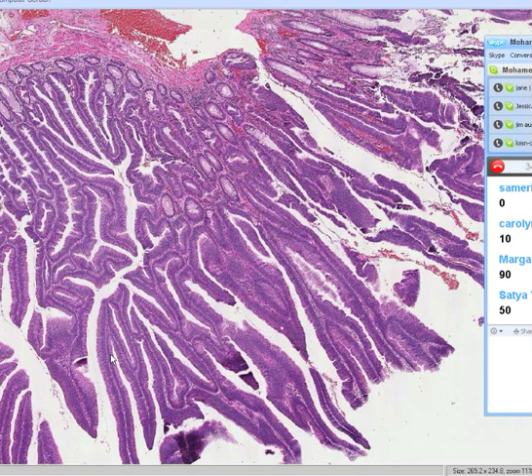Here it is. And you'll probably all see it in a few seconds. And I know you're going to get this one, even if I have to torture you into getting it. Okay, you'll be seeing a change pretty soon. In about 5 seconds, I think everybody will see a nice slide up here.